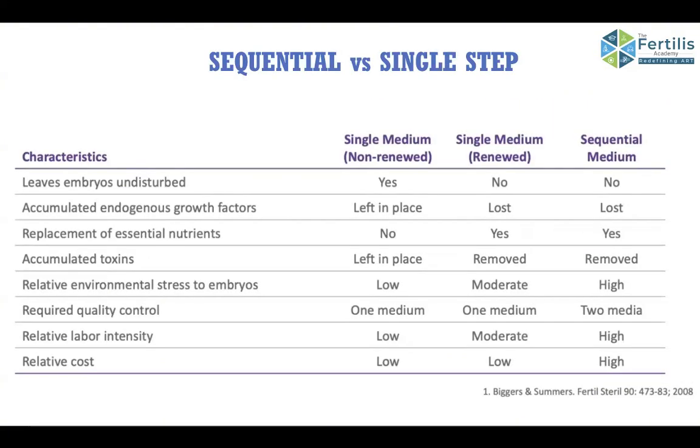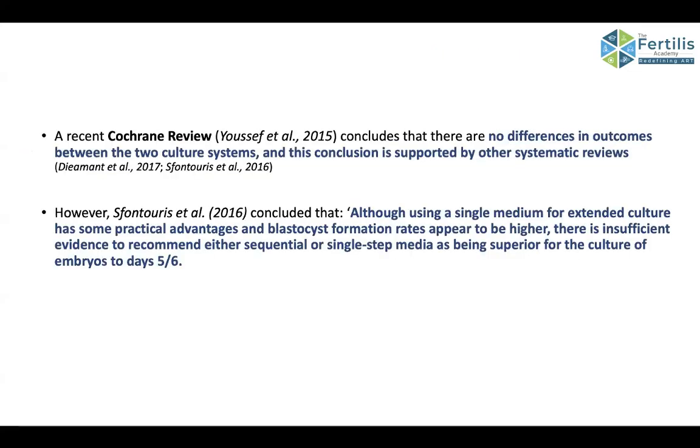When you talk about single step versus sequential, there have been a lot of studies, but recent Cochrane reviews have shown that we really can't choose one media over the other. Whichever suits best in your lab, use that media.